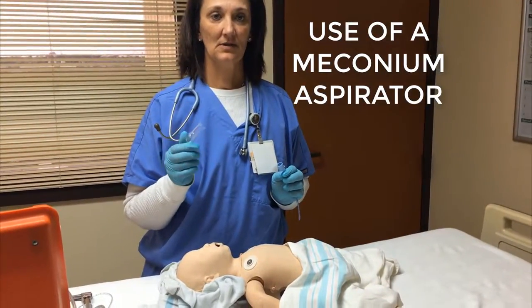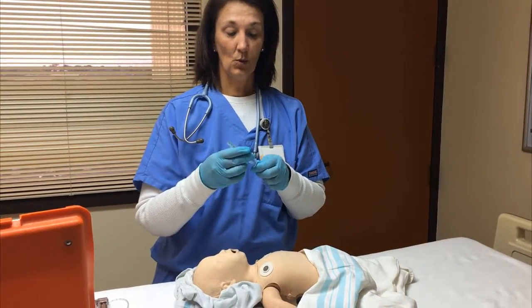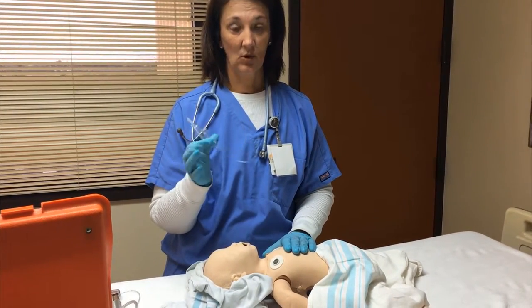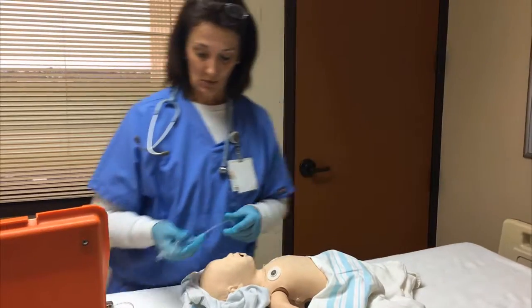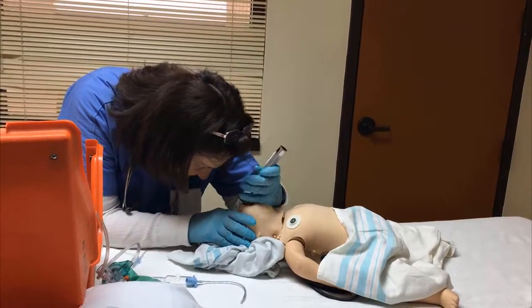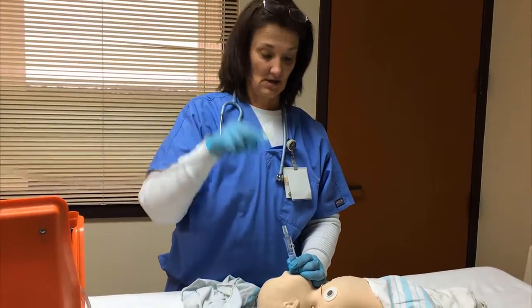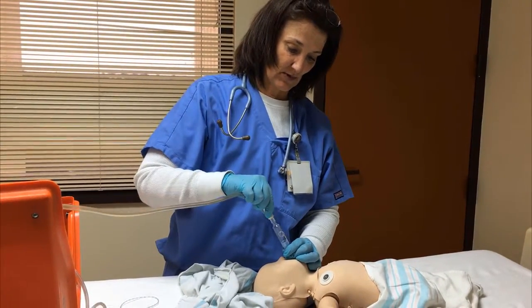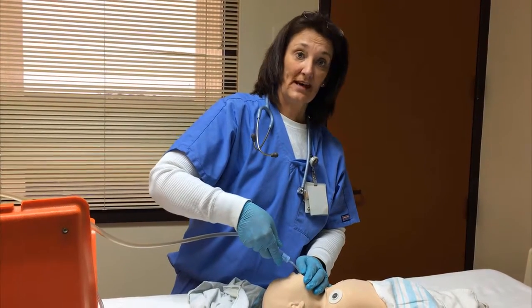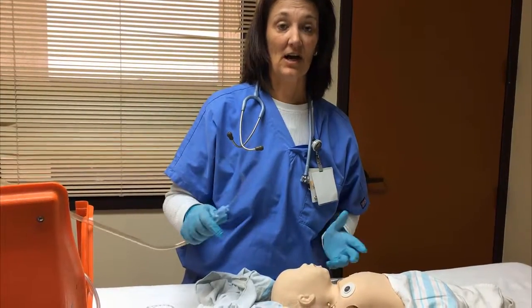The next thing we're going to review is the meconium aspirator. It's a little plastic device. We will use it with an ET tube of the corresponding size for the size or gestational age of the baby. So what we're going to do is we're going to go ahead and intubate the baby using our ET tube. Once we've inserted the endotracheal tube, we attach our suction directly to the meconium aspirator. We can go ahead and occlude the meconium aspirator, pulling out over 3 to 5 seconds in order to get out all of the secretions that are blocking the baby's airway.